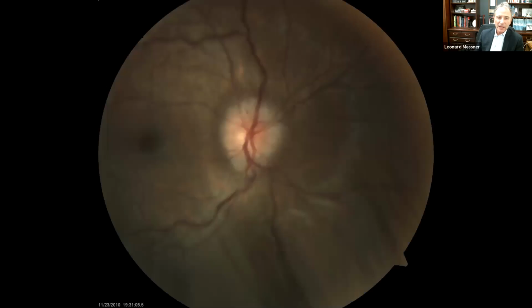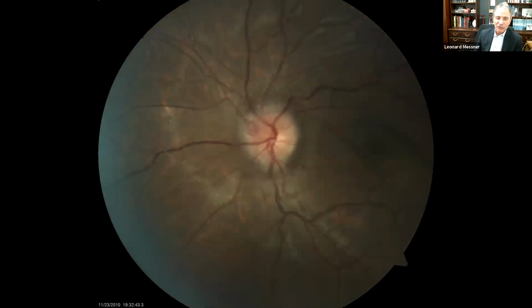And if we look at the optic nerves, here in the right eye, we see this circumferential corona of optic disc swelling, obscuring the juxtapapillary major blood vessels as they're emerging from the optic nerve. In the fellow eye, we see rather similar clinical findings, here with a little bit of blood involving the superonasal quadrant of the optic nerve.